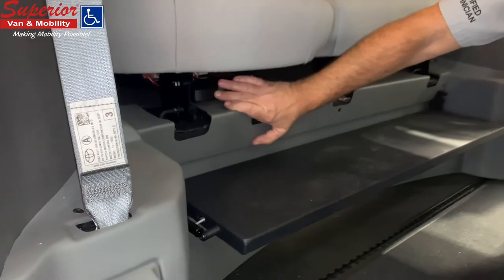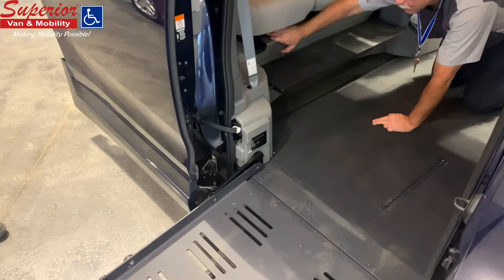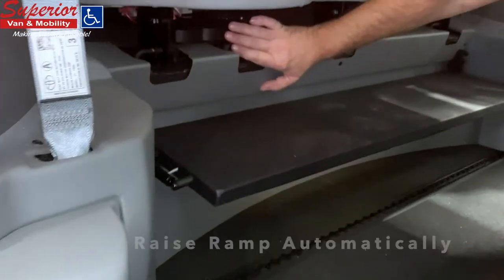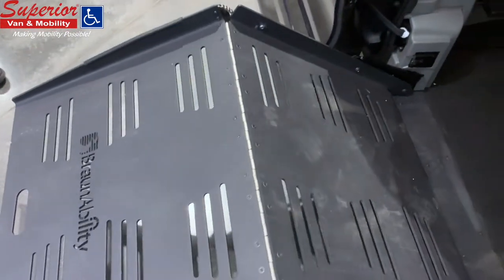The button closest to the ramp will release the kneeler to the up default position so the vehicle can be driven. The other button will bring the ramp up automatically and you can close the door manually.